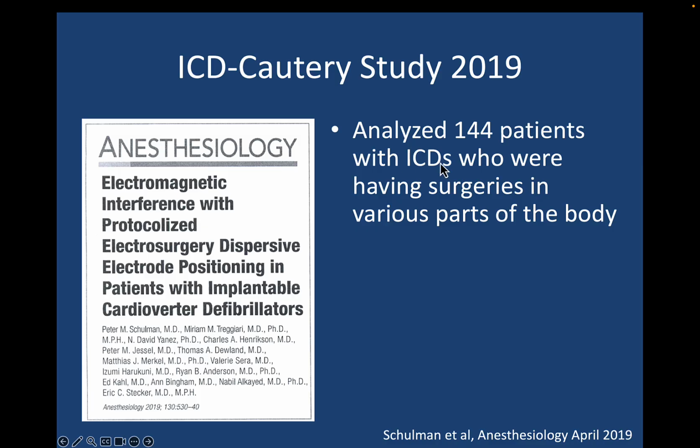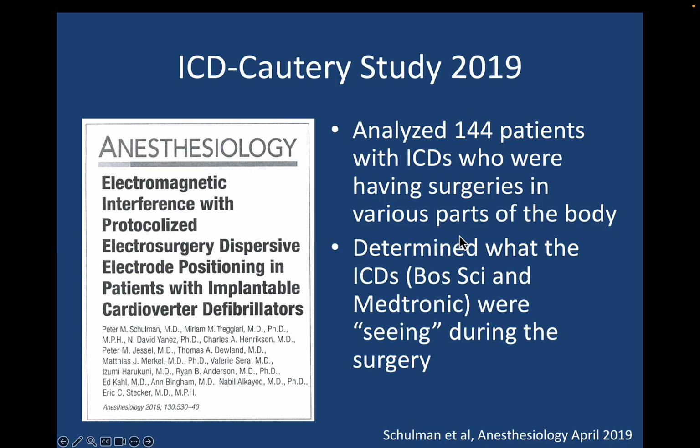Now, this is a bigger paper. This was Peter Schulman's group, and they looked at 144 patients who had ICDs having surgery on various parts of the body, and they also sort of turned off the anti-tachytherapy treatment, but they kept on the sensing of the Boston Scientific and Medtronic ICDs in this study.